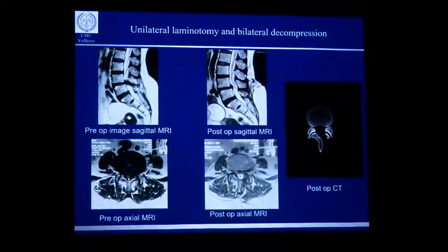The advantage is that we are not disrupting the interspinous ligament, the supraspinous ligament; everything is left intact. So it is a minimally invasive method to decompress the thecal sac fully. And in case the recesses are a little smaller, you need to remove the recess, making sure that there is no compression of the root at the recess also.